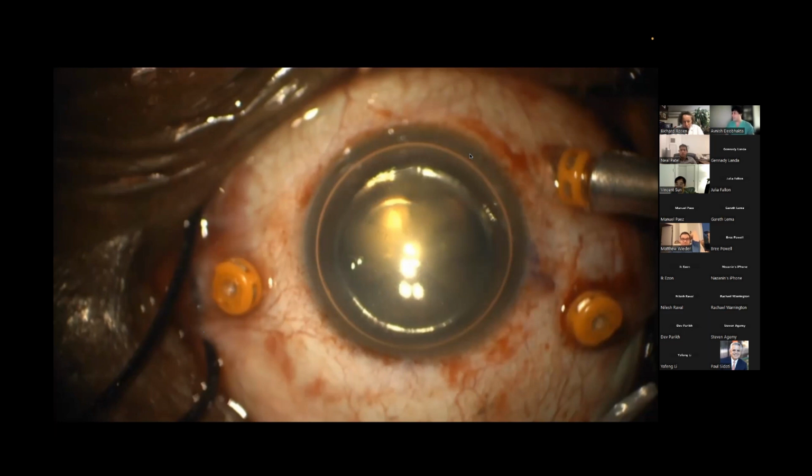I mean, that's going to be a little bit more difficult. Yeah. You're already going to need to take the lens out anyway. But in this case, I agree with everyone that this is live to fight another day. No cold third strike right now. I agree with Ike, 100%.